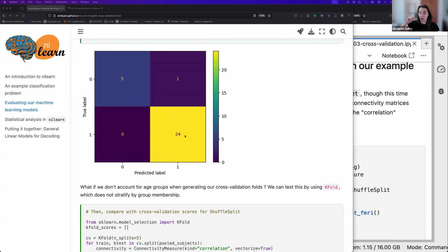So yes, when you calculate chance level, you don't just want to be thinking about the number of classes you have. You want to actually be thinking about, in this particular sample, what's the distribution of classes that you have. And when you do your cross-validation, there are, as I said, many different schemes, but given the amount of imbalance you have, there are many different ways to account for that and move your chance or to move your classification sensitivity.